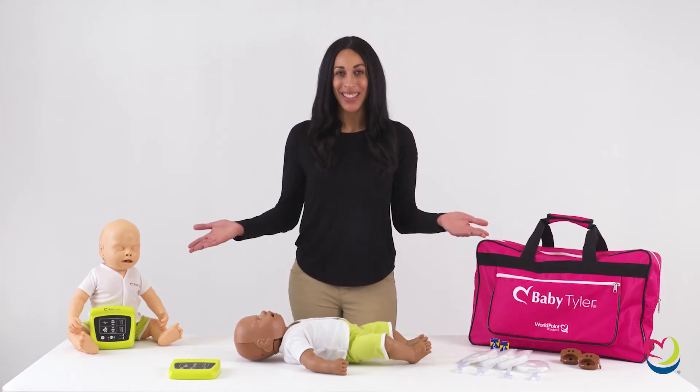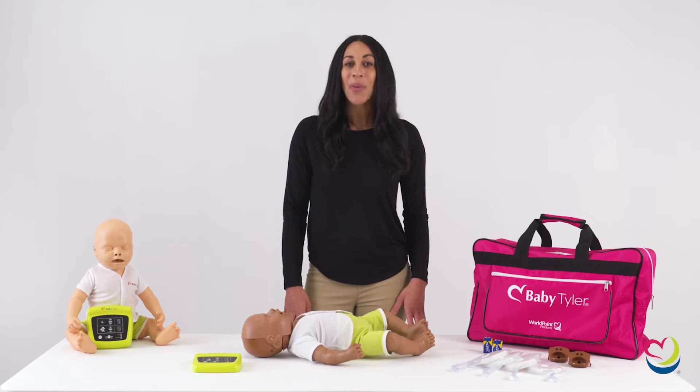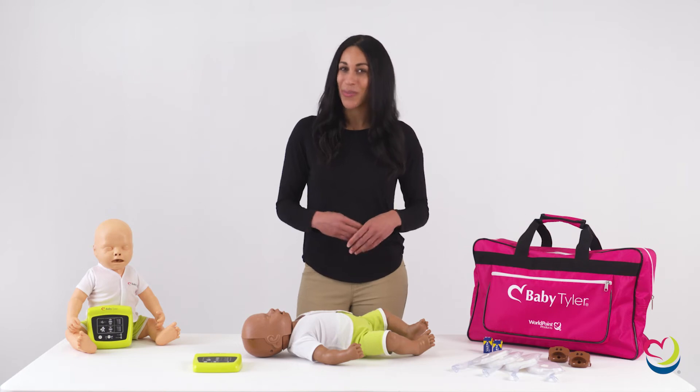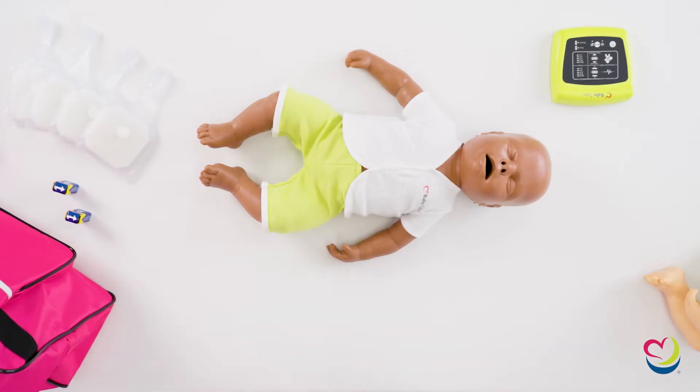Introducing WorldPoint Products Baby Tyler, the CPR mannequin that's reflective of real infants. We know lifesavers like you want realism in your training. That is why we set out to create CPR mannequins that are adaptable to simulate different patient characteristics without breaking the bank. With Baby Tyler you can easily and affordably add diversity to your training to help champion health equity and save more lives.